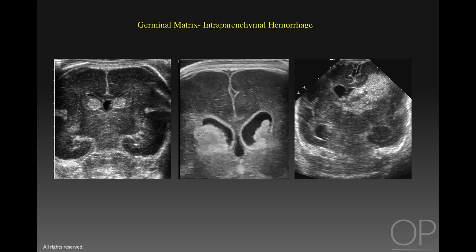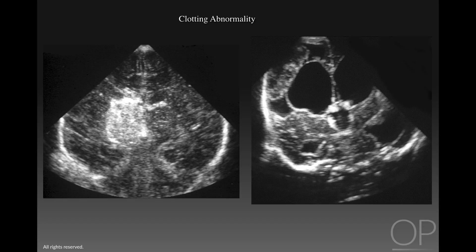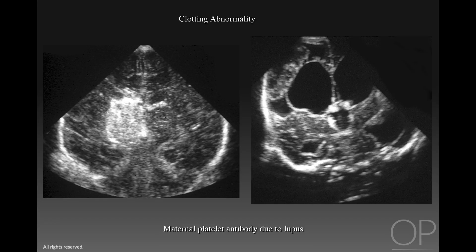Hemorrhages in term and near-term infants are often different in location, cause, and appearance. Here are two near-term infants with a clotting abnormality. The infant on the left side has a brightly echogenic thalamic hemorrhage. The infant on the right has post-hemorrhagic hydrocephalus and a moderately echogenic clot in the parietal region. Both infants were born to mothers who had lupus and had platelet antibodies.